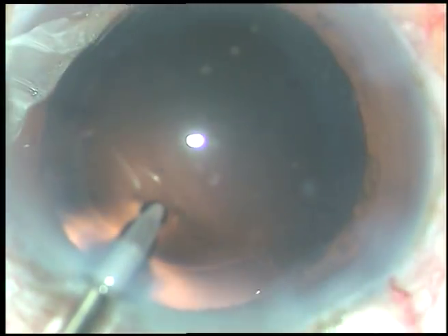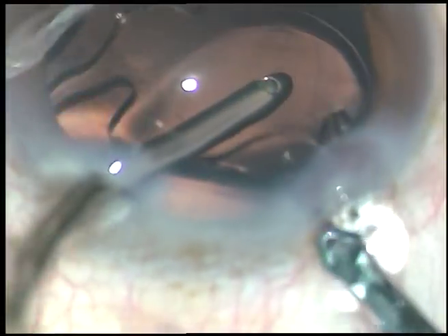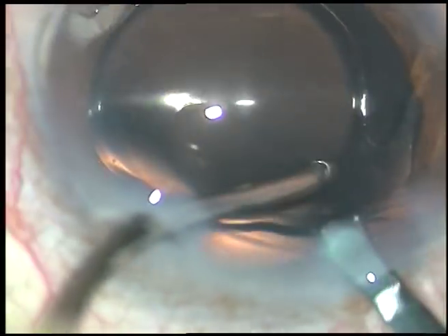The posterior capsule is clean. Now a hydrophilic acrylic foldable intraocular lens is being implanted in the capsular bag.